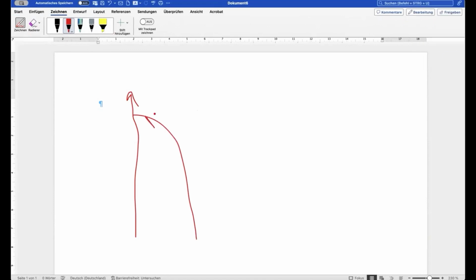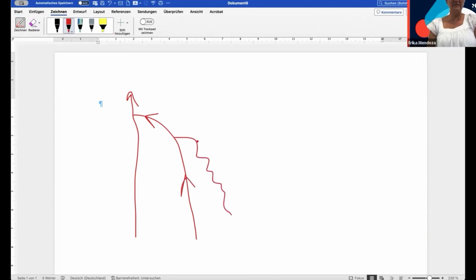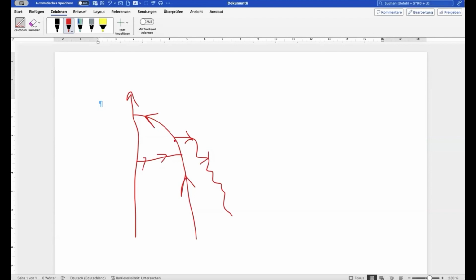Yeah, thank you, Erika. Now we have the anterograde flow in the great saphenous vein. We have the refluxing tributary, which is really refluxing. Then we have the perforating vein, which is also refluxing. And we have a strange situation, not very often seen: this segment of the great saphenous vein has a diastolic flow, but it is antegrade. So we have a reflux in this perforating vein. The reflux goes anterograde upstairs and then retrograde through the tributary.